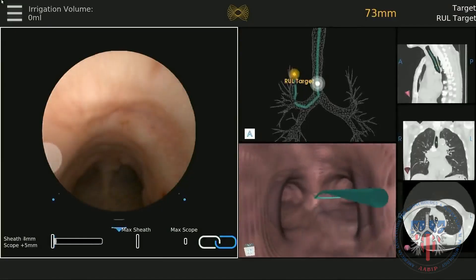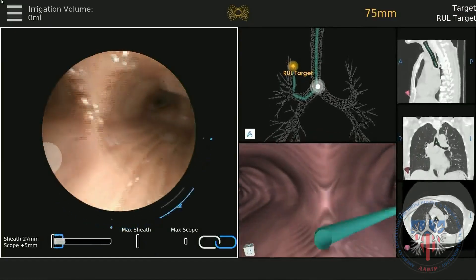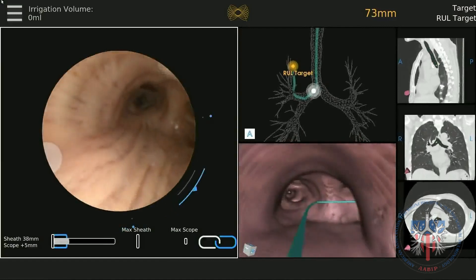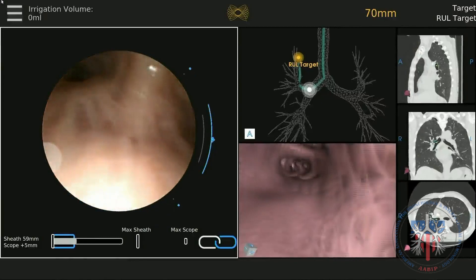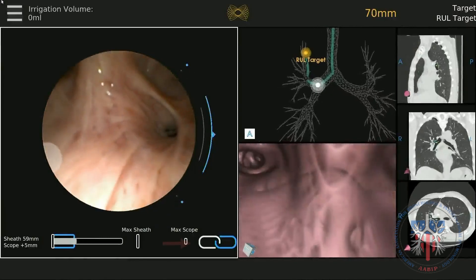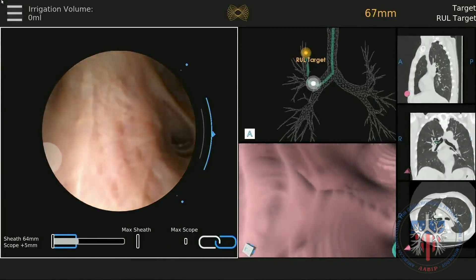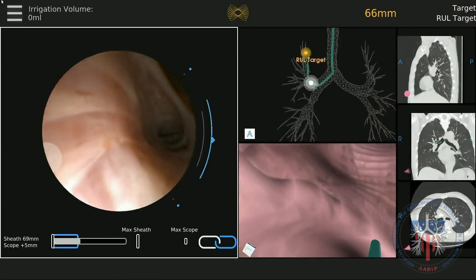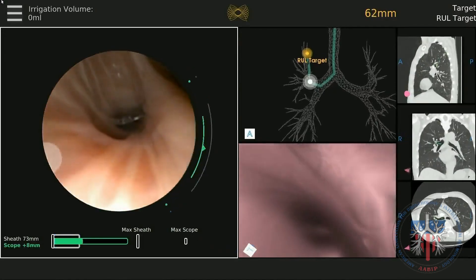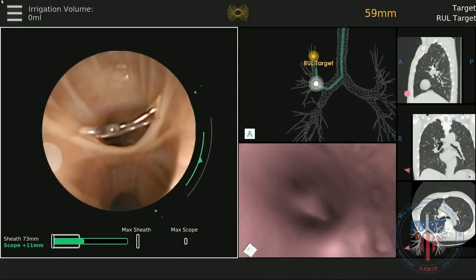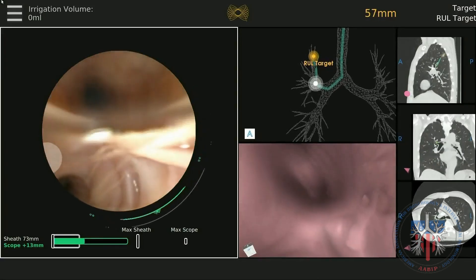Navigation portion. Follow the virtual bronchoscopic pathway toward the target. You will first be driving both the sheath and the scope — you will know this because the chain link at the bottom will be shown and it will be blue. If traveling to the bilateral upper lobes, you will need to transition from sheath navigation to scope navigation. Once the sheath is wedged, hit R2 to switch to the scope navigation.